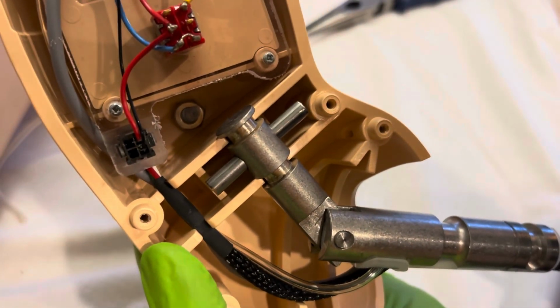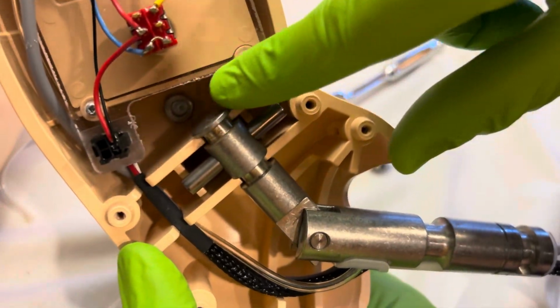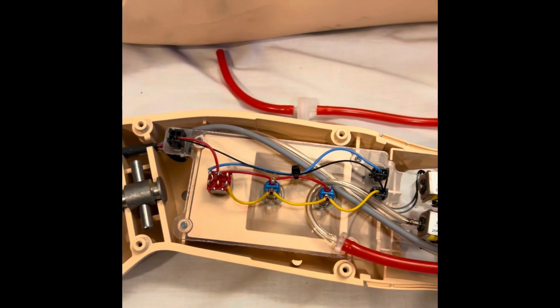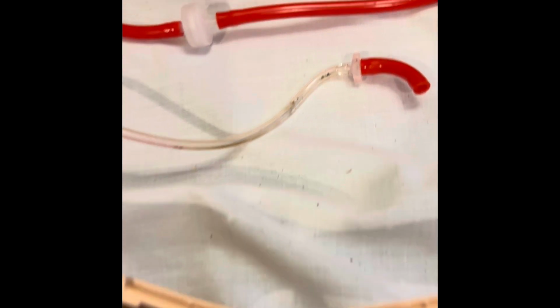And now I'm going to use my 11mm deep shell socket to ratchet it down because I can see that it's evenly on right now. So, all right, you might have some hoses that are free, so just go ahead and take this part, like I mentioned, out of there. This one you can take out. We're actually going to reuse this reducer here, so connection point. So save that for a minute.